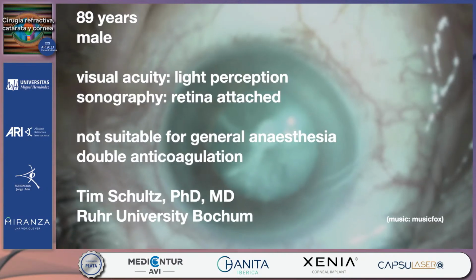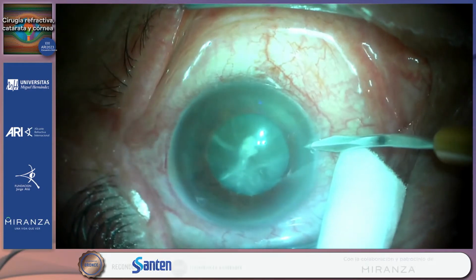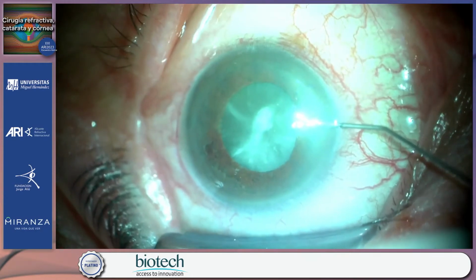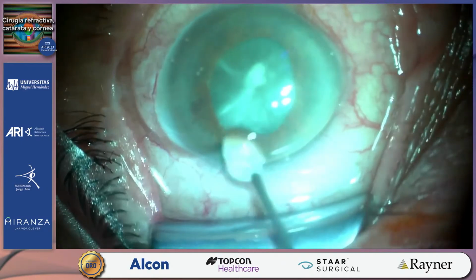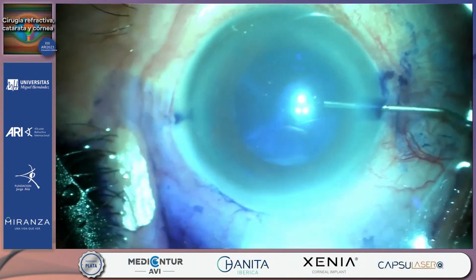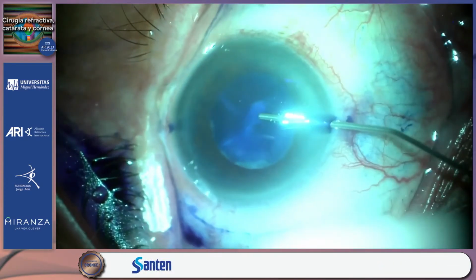Andrew, are you there? Dear ARI 2023, my patient was an 89-year-old male with light perception, and he was not suitable for general anesthesia. After paracentesis, lidocaine and suprarenin were injected. Next, Capsuvisc was placed on the cornea. Next, Capsublue was injected into the anterior chamber. It allows a very intense staining of the anterior capsule. After 1 minute, balanced salt solution is used to rinse out the color.